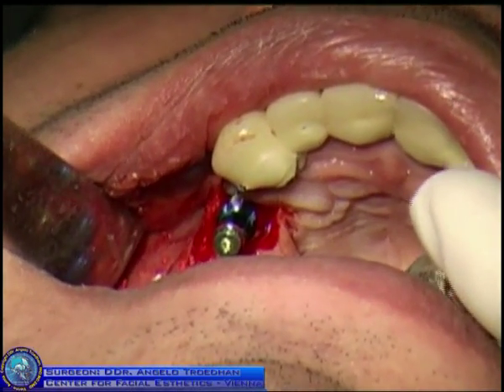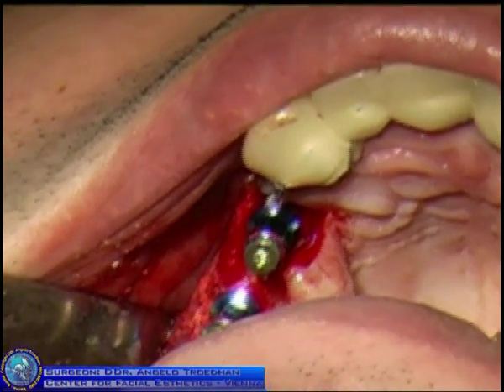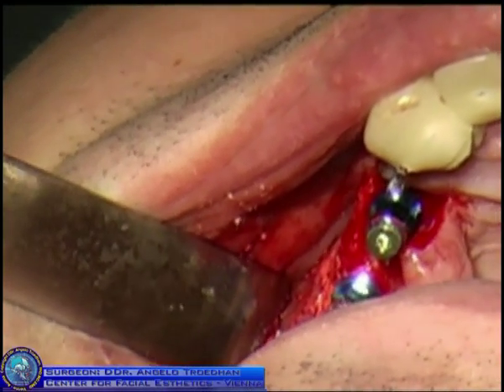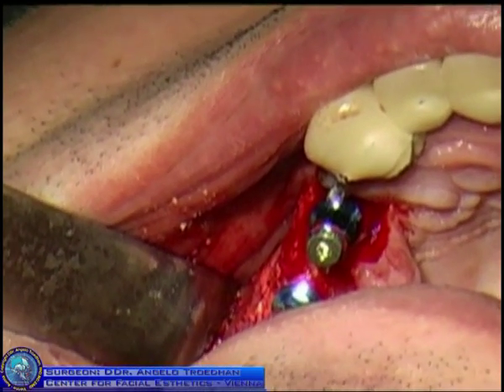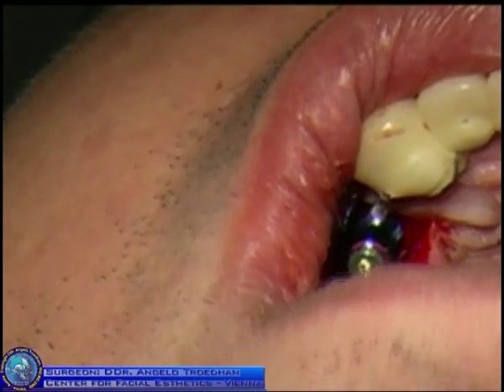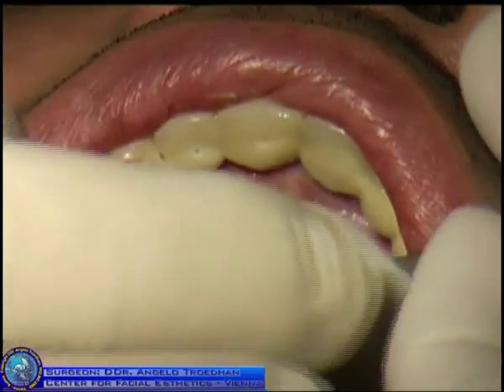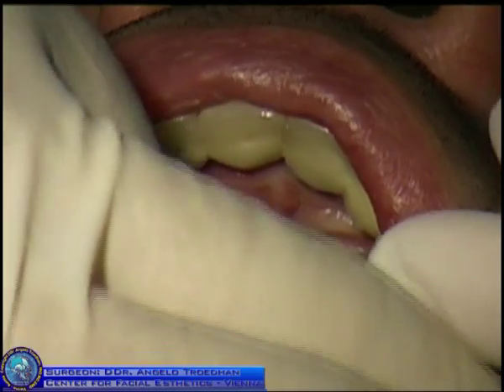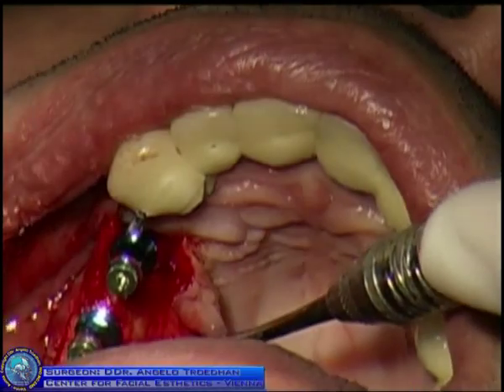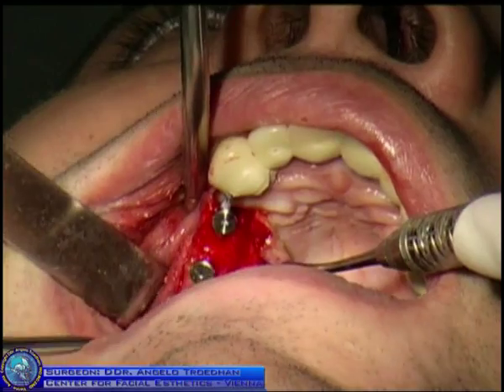Of course now we could discuss if the two last implants are not put a little bit close to each other. You are right. But since chewing forces are highest in the molar region, I like to have the implants always in the region with the highest loading. Okay, and now this is the final result.